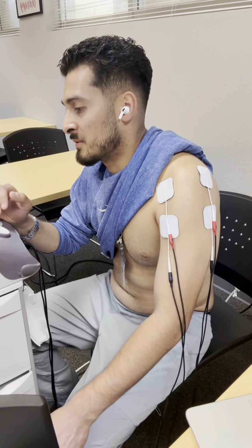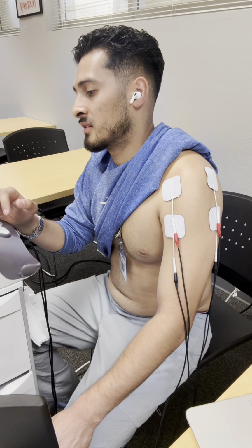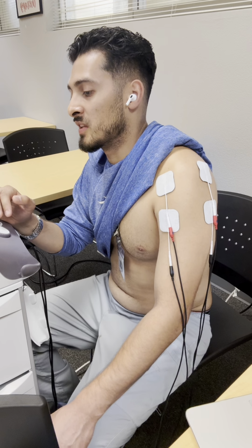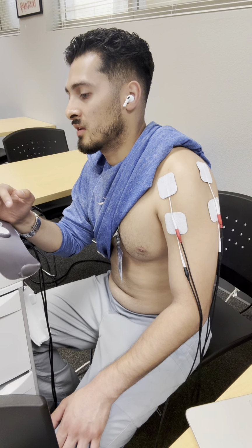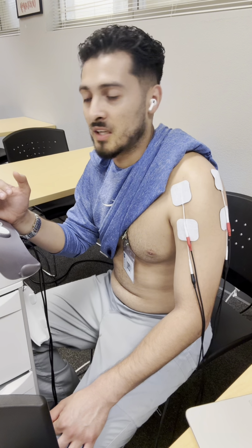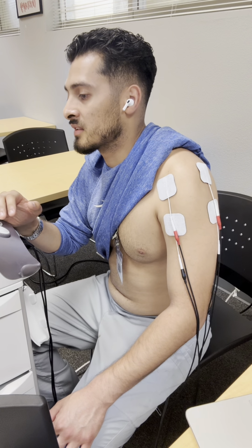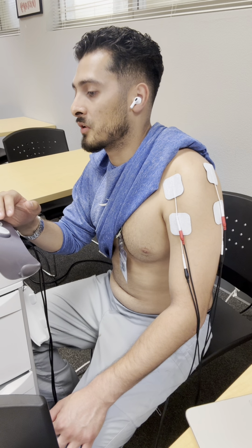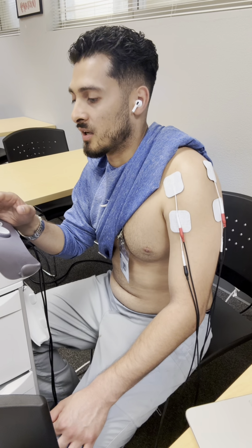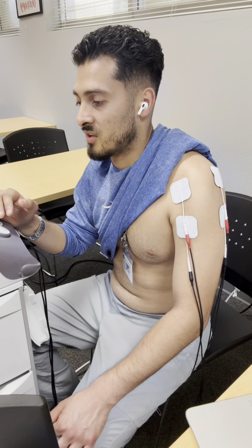Total treatment time, it'd be anywhere from 20 to 30 minutes. I'd say about in between that. You don't want to do more than 30, and anything less than 20, realistically in a clinical setting, it'd probably be way less than 20 minutes. But it's really good for controlling that pain there. Get the best of both worlds, the opioid release as well as the gate control theory.